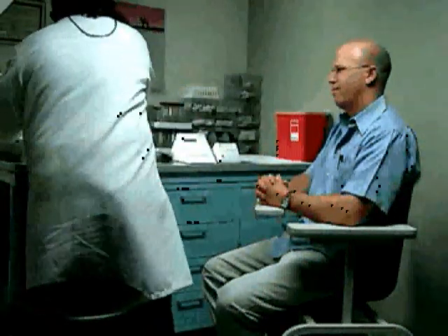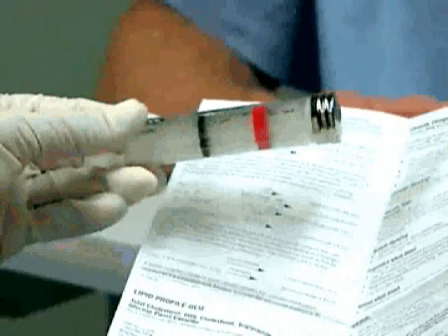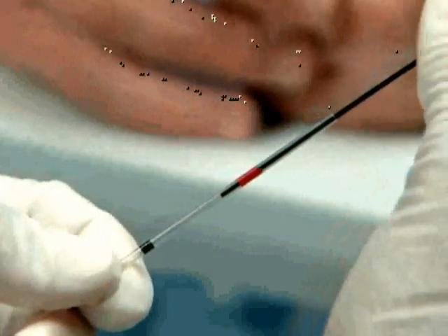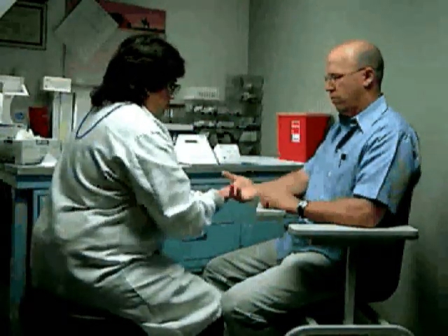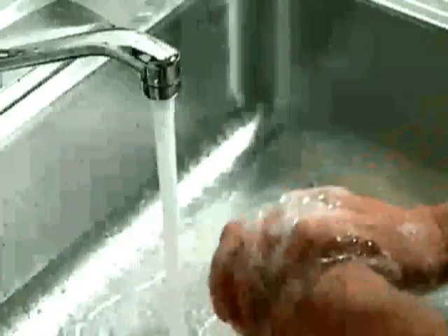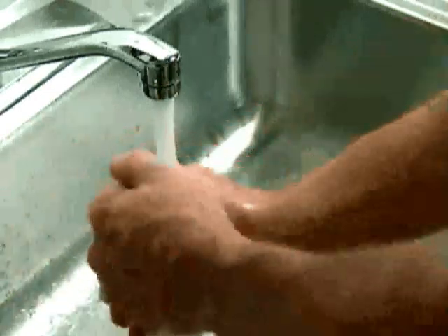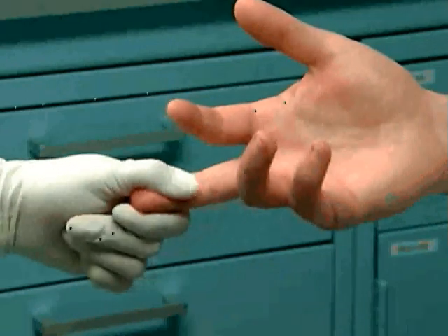The most common method of sample collection for the Cholestec LDX system is from a finger stick. The patient should sit quietly for 5 minutes before the sample is collected. Refer to the test cassette package insert to ensure you are using the correct capillary tube. Prepare a capillary tube by inserting the plunger into the tube at the end with a colored band until the plunger reaches the black line. The hand should be warm and relaxed. Have the patient wash their hands with bar soap and rinse with warm water, or use a heating pad or warm compress. You can also gently massage the finger from the base to the tip several times to help bring blood to the fingertip.